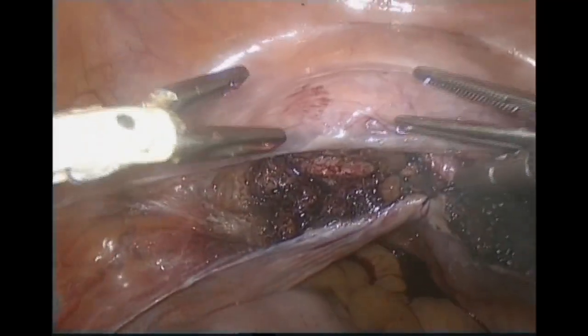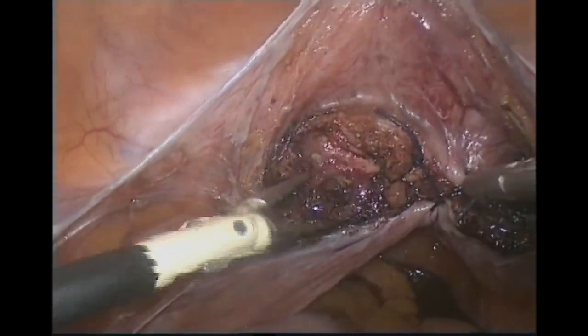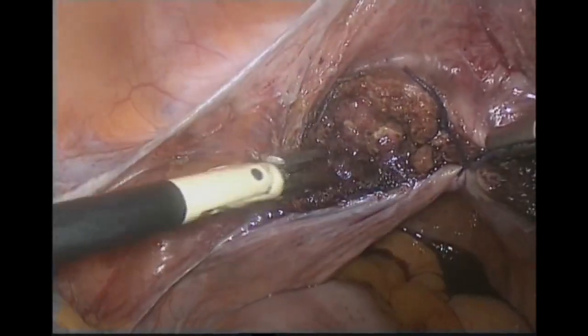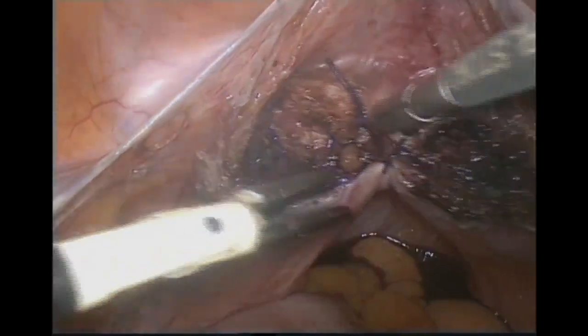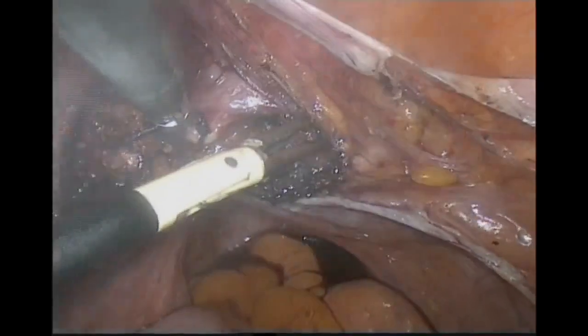go with another port to complete hemostasis, and check the hemostasis by 4 to 8 millimeters of mercury deflation of the abdomen to avoid any venous oozing. As you see, please, very important, many patients had an open laparotomy post-operatively after TLH because of venous bleeding. So try to keep dry, try to keep safe.